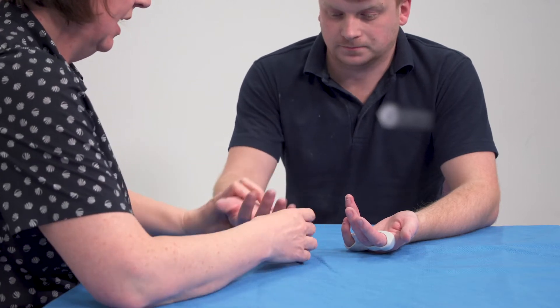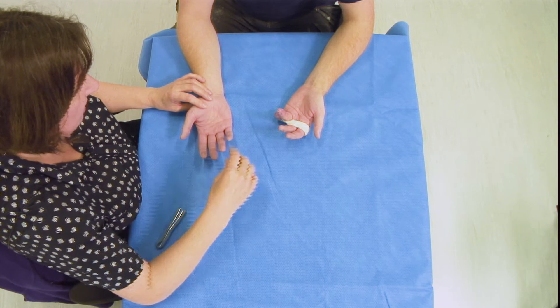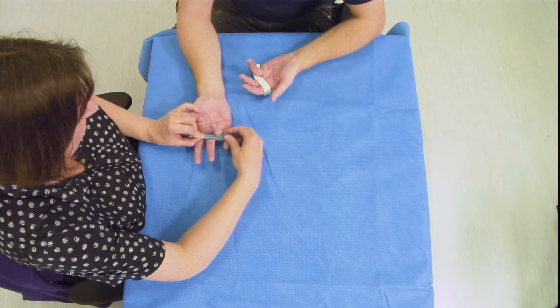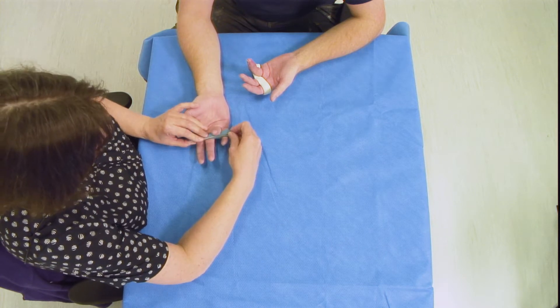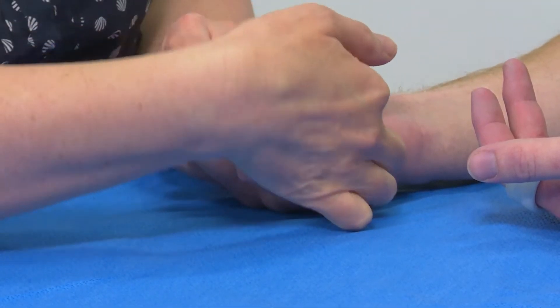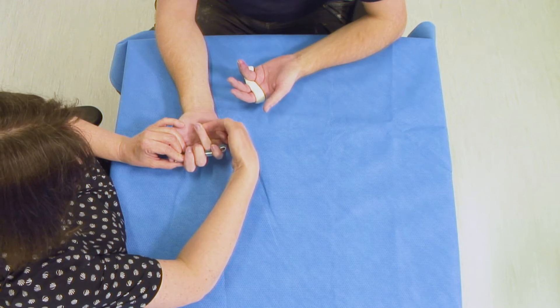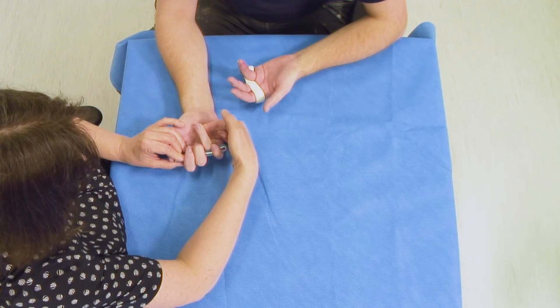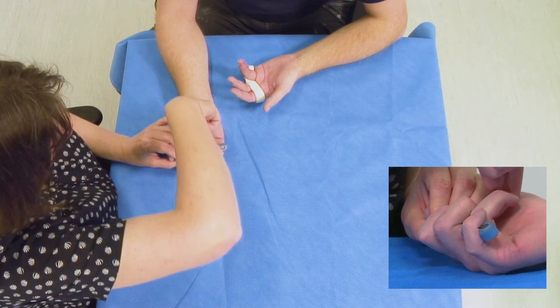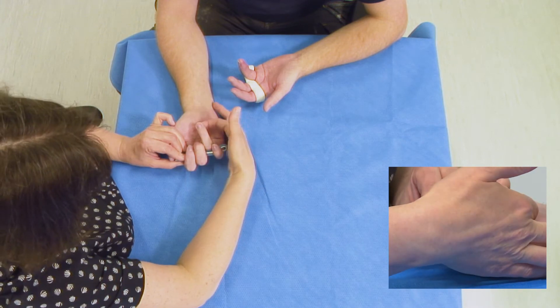If we take the normal hand — it's the ring finger that they've injured on the other hand — we're going to temporarily put a relative motion splint in there. If I now ask you to make a fist, I can see that the FDP is able to pull through into this finger across the DIP joint, but it's nothing like the normal amount of power compared to the other fingers that aren't in the relative position.